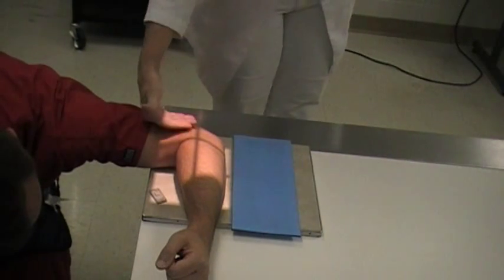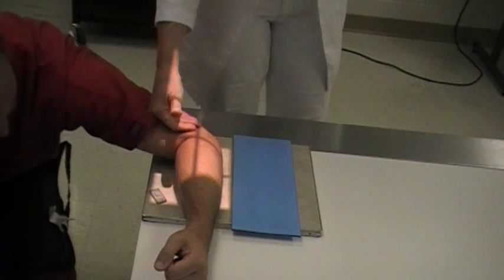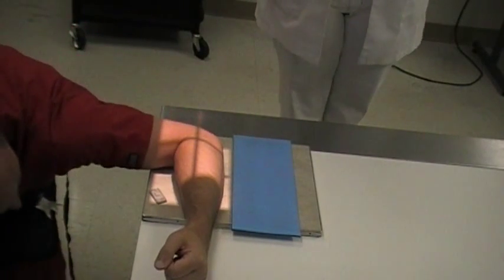Always double check, make sure that this humerus is touching. Okay, that's good.